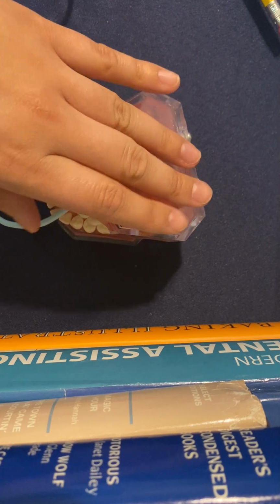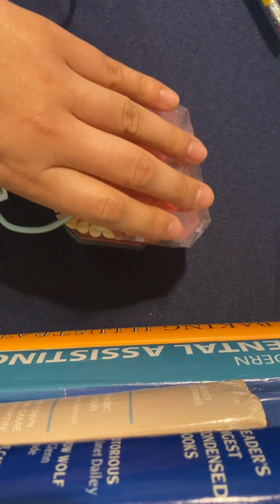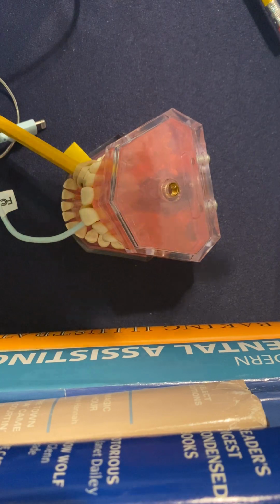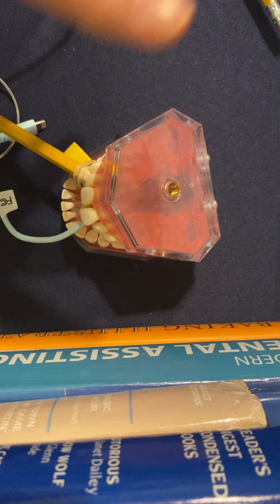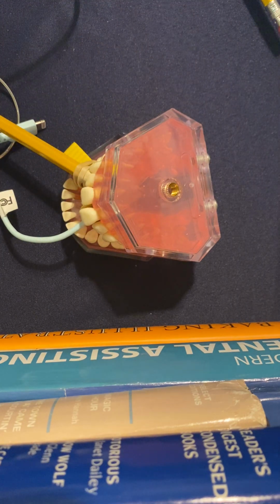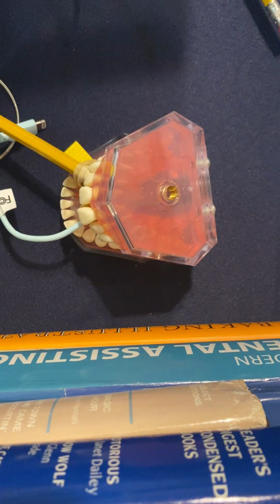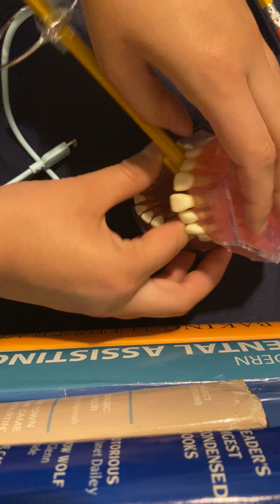The teeth that you're going to want to see on this: you're going to want to center on the second premolar, I don't know why I said canine. You're going to want to see the distal of the canine, the first and second premolars, and the first molar, crown and apices. So get it nice and bitten down, and get your little PID. Oop, popped open. It wasn't supposed to do that.